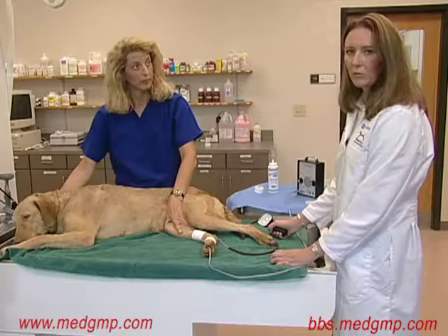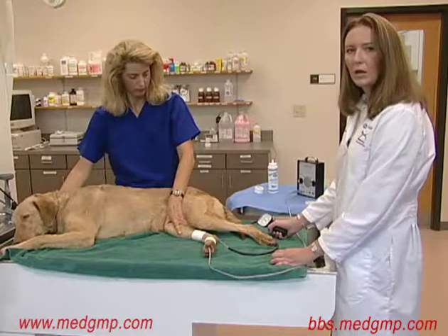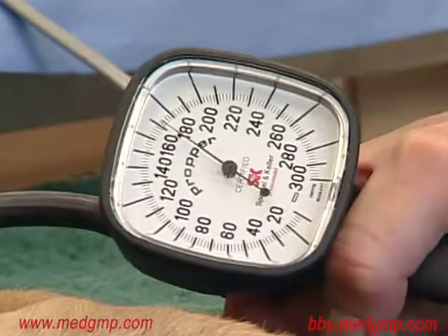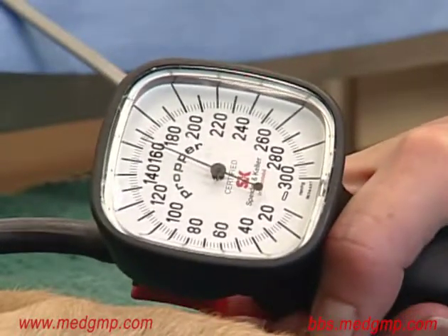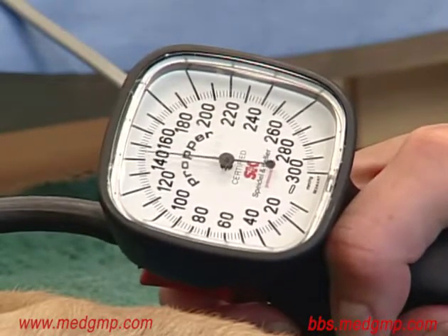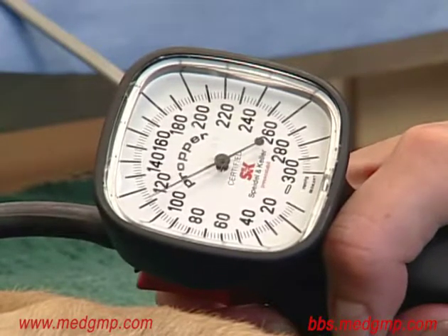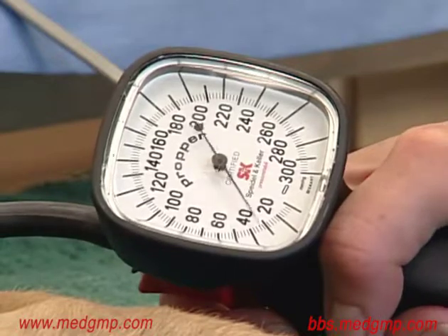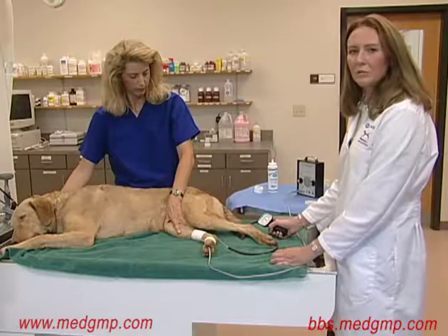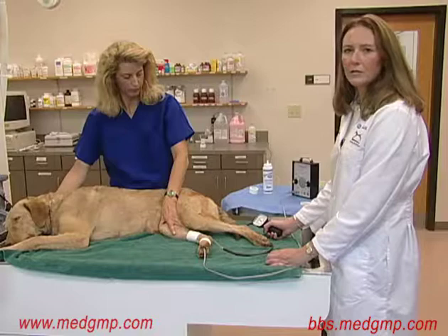Once we have obtained one reading, we go ahead and repeat the measurement, allowing the dog about 30 seconds between measurements. It's also important to allow the cuff to completely deflate between measurements. Again, we're inflating the cuff past the point where the sound disappears, then slowly deflating it by releasing the red button. The sound came back at around 118 millimeters of mercury. We usually repeat this measurement at least 5 to 10 times to get an average reading. If there are any outliers, it's important to throw these out.